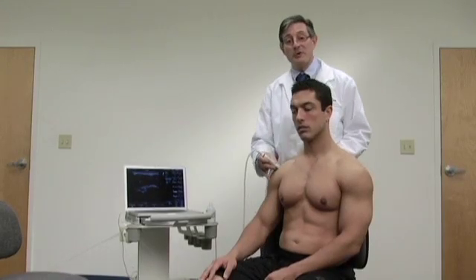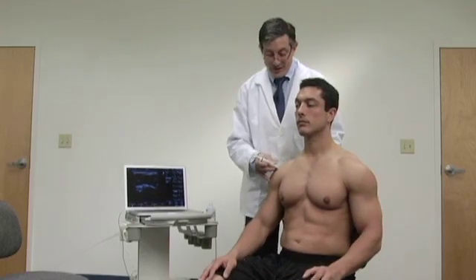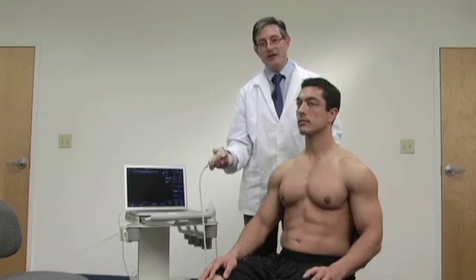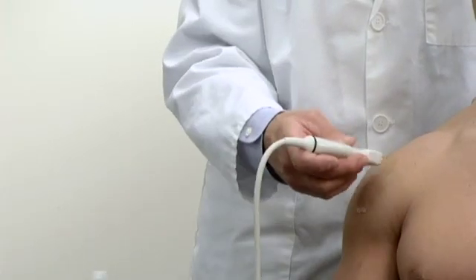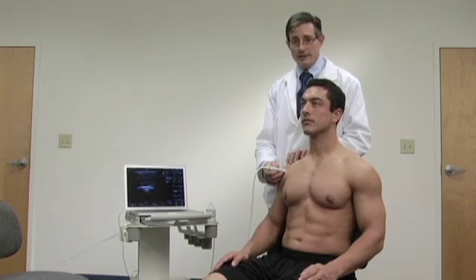Now let's go through a brief review of some of the things we covered earlier. Remember that the notch of the probe will be placed to the patient's right for a traditional image. When we examine a part, it's a good idea to have a systematic approach — either look at the structures from the bony cortex up, or from the skin down.